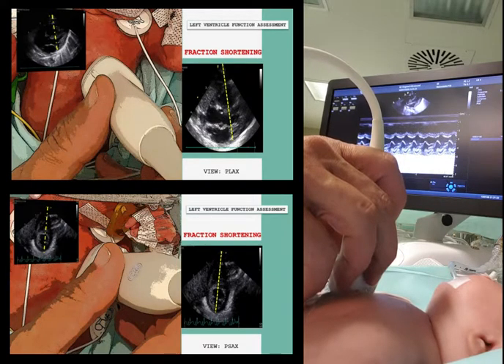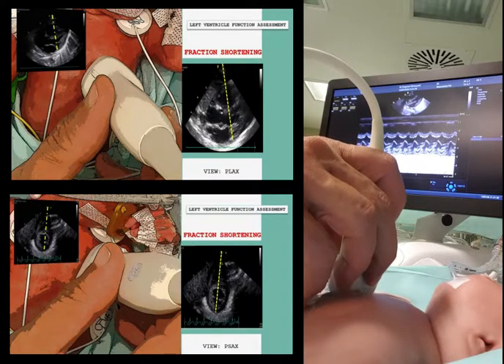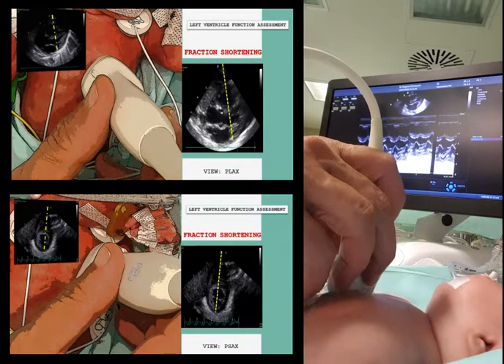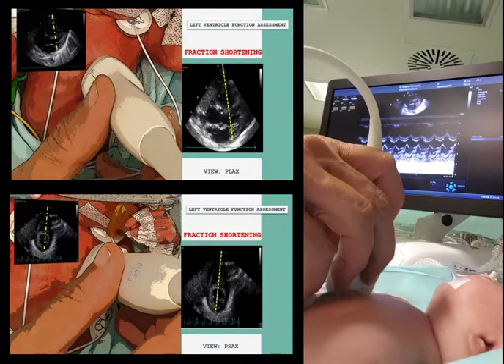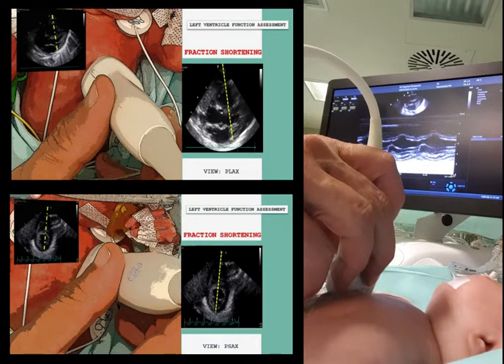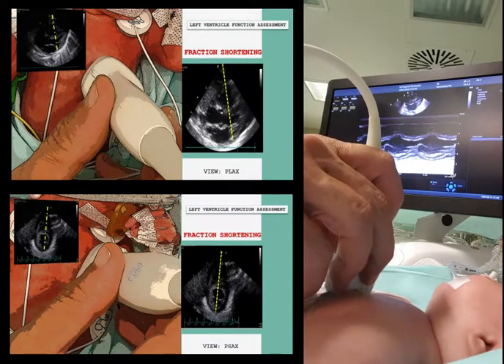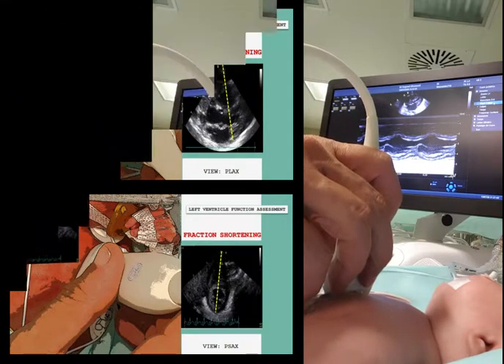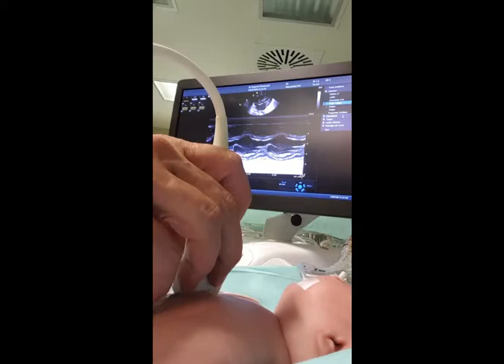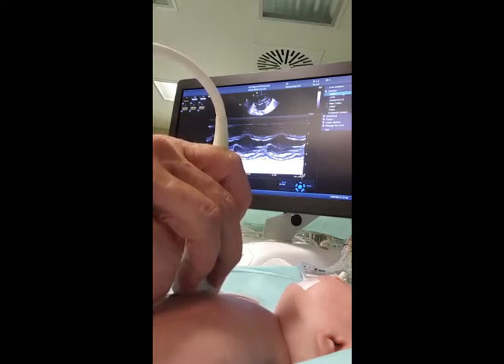The left ventricular fractional shortening is obtained from M-mode tracings or two-dimensional imaging in the parasternal long axis view, at the tips of the mitral valve leaflets, or in the parasternal short axis view at the level of the papillary muscles. The left ventricular end diastolic dimension is measured at the R-wave of the cardiac cycle, and left ventricular end systolic dimension is obtained at end of the T-wave.